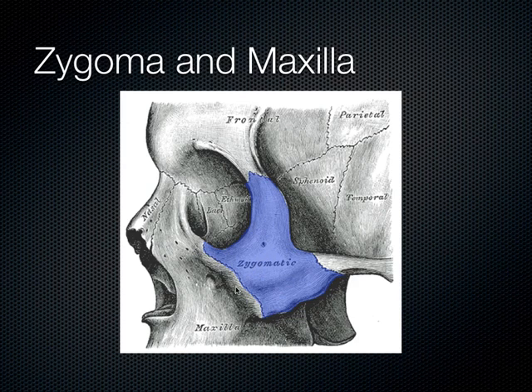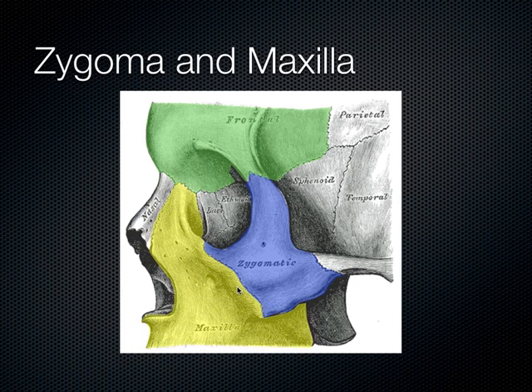And so a zygoma fracture will usually have 2 fracture lines, as in the case of any ringed structure. There's usually a break in 2 places. You can think about some of the rings in the pelvis. That happens as well. But we can see the various bones here on ultrasound. Actually, we can see the frontal bone quite easily, and we can make out the maxilla as well. Even the nasal bone is seen quite easily on ultrasound. So when we're looking for a fracture, specifically of the zygomatic arch, this is the technique that we're going to use. And here's Alan demonstrating that.